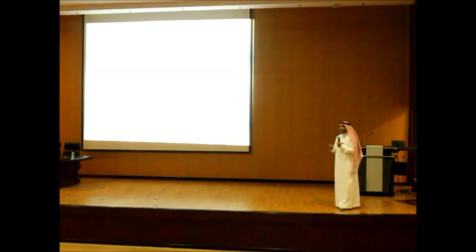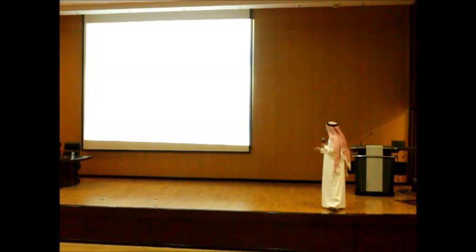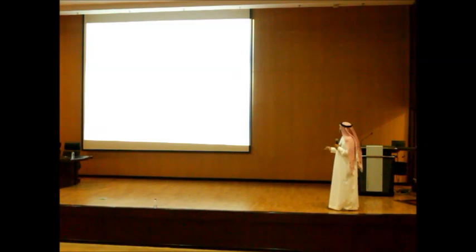What's the normal rate of the AV node? 40 to 60. What is this patient? 1, 2, 3, 4, 5, 6, 7. What's 300 by 7? 35. Yeah, by 7?